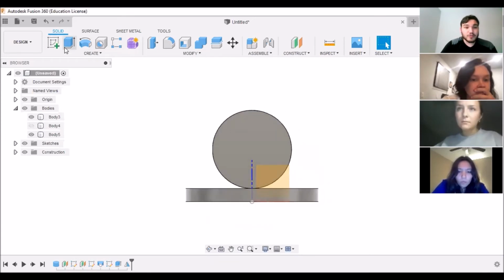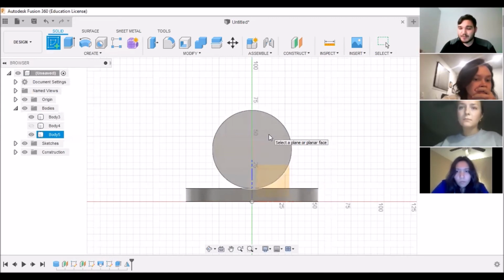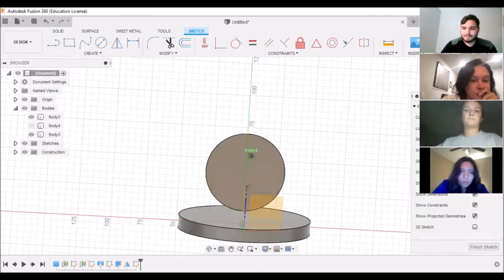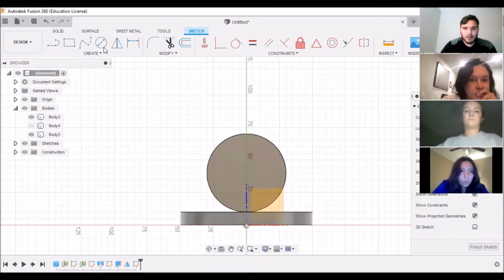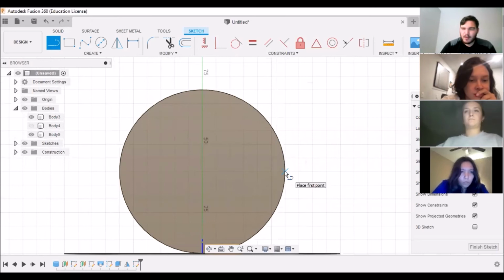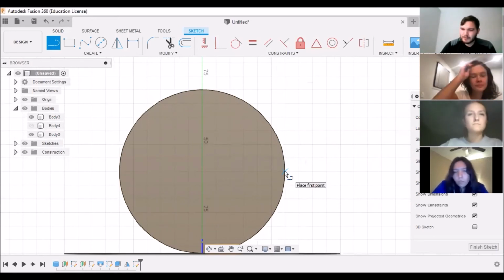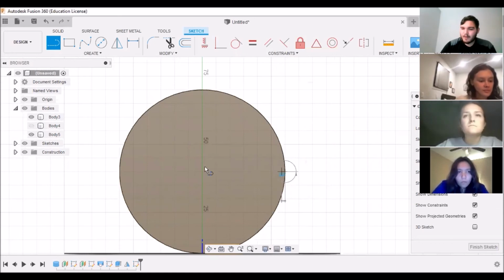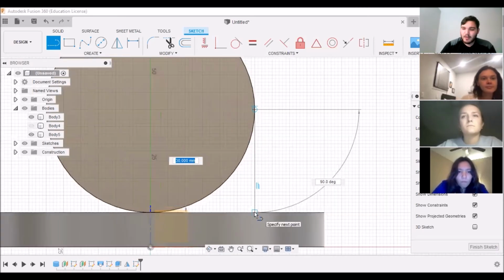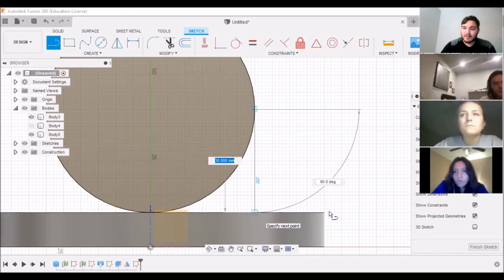So now we're going to sketch on the back of the copied face, or copied cap face, if that makes sense. So the big circle that's facing the inside of our joint. Once we're here, we can go to line up at the top. Find about halfway, yeah, halfway up on the outer circumference. You can click that. And then now just drag completely down, perpendicular to the base. And then once you hit the edge of the base, you can click that again.